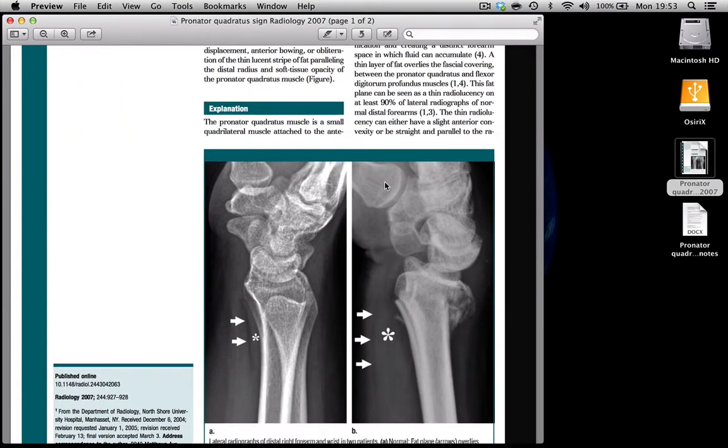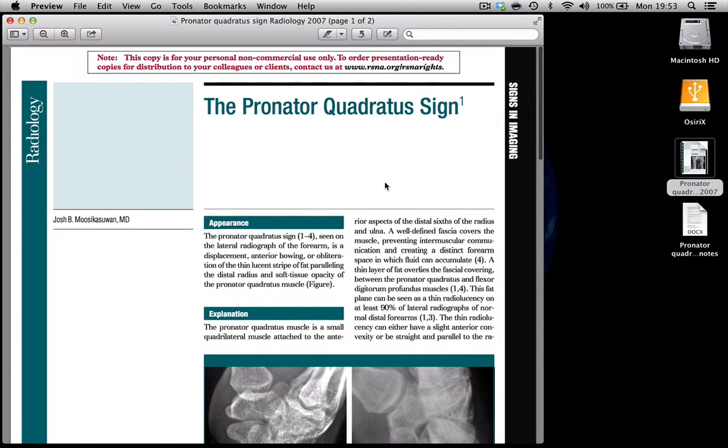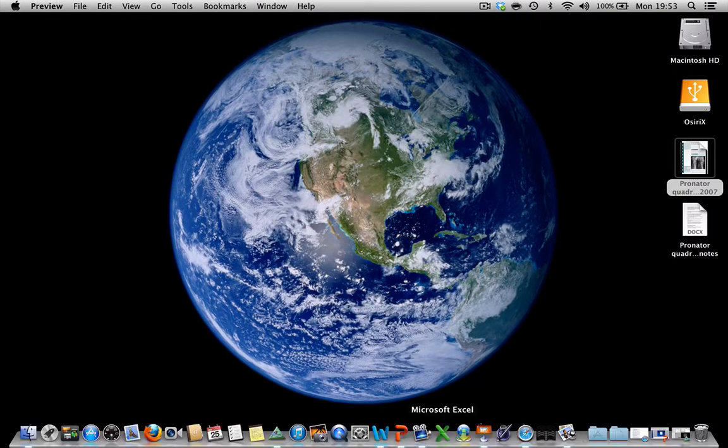And I remembered that I have a case in my collection with exactly this sign and thought this would be nice to add to that case.